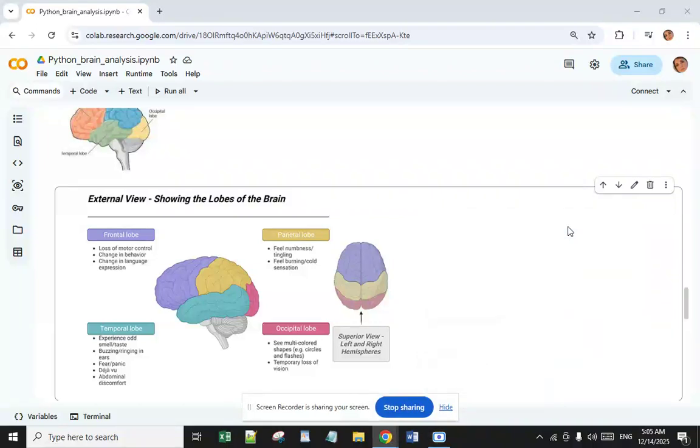In the name of Almighty God, I am Mahsa Hassankashi, and today I want to talk about Nilearn and convolutional neural network for brain analysis.